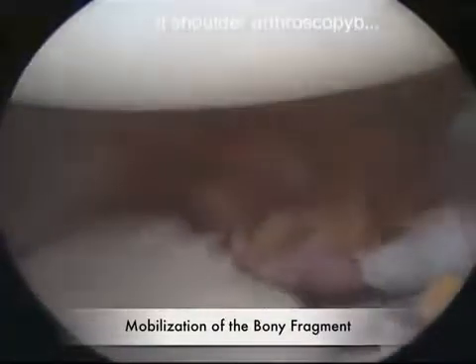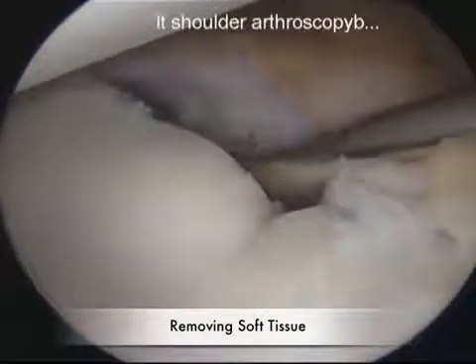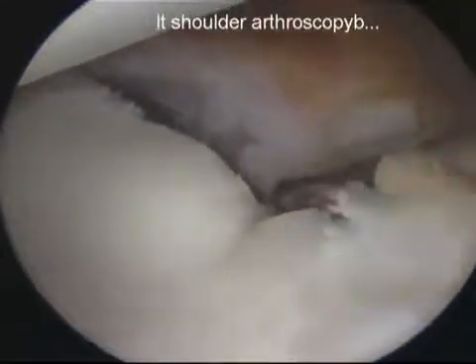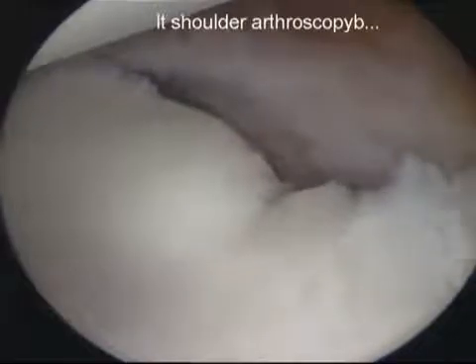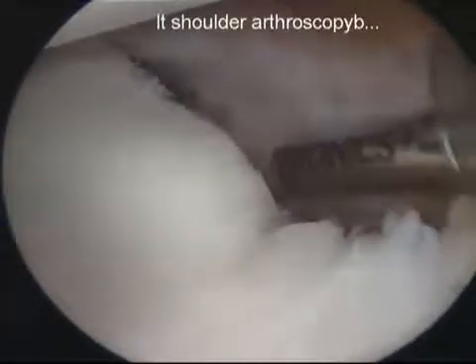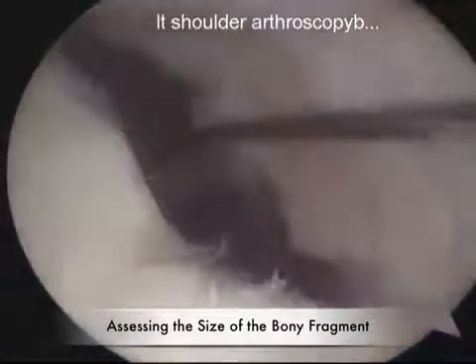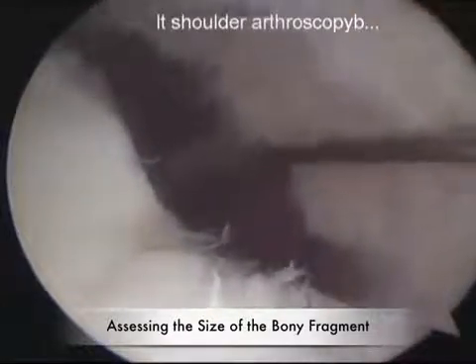Attention is then turned to freeing up the bony Bankart fragment, which is healed medially to the glenoid. An arthroscopic liberator is useful for separating the two fragments. The shaver is used to remove all soft tissue in an effort to maximize bony surface area. The bony fragment is probed to assess size and mobility.